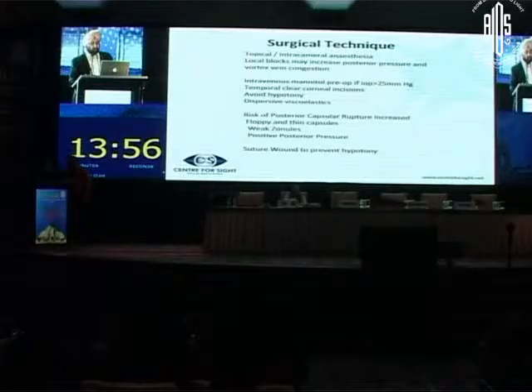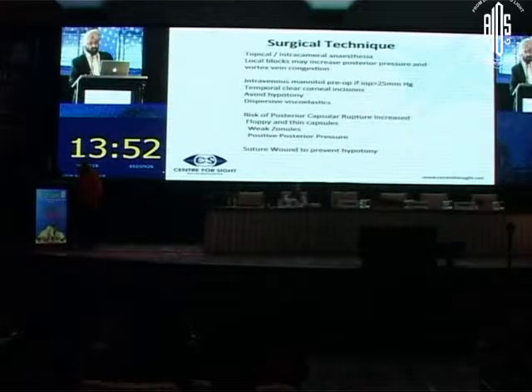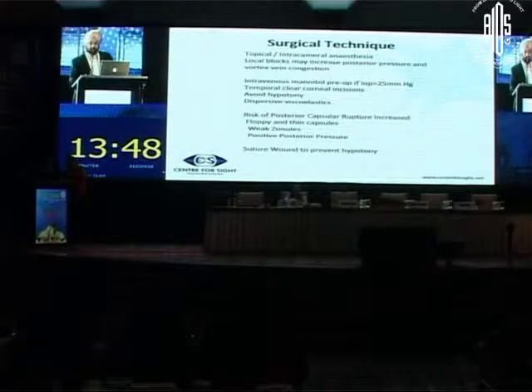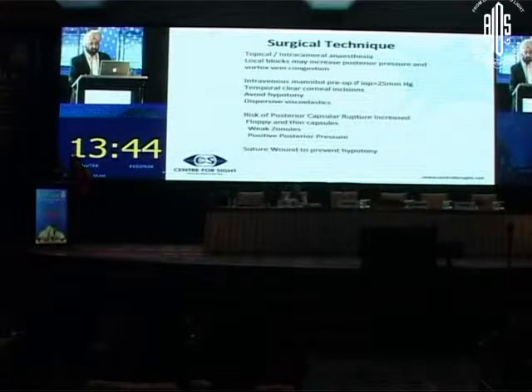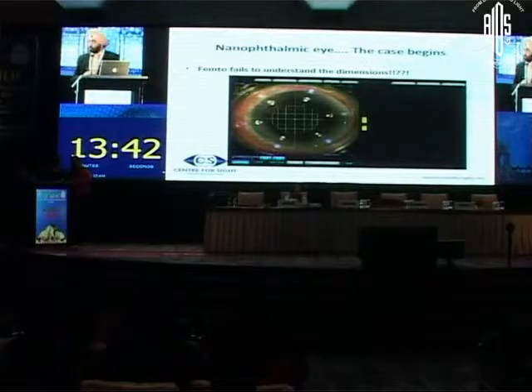Use good viscoelastic, and the risk of posterior capsular rupture is definitely increased because of the floppy and thin capsules, the weak zonules, and positive posterior pressure, and you might need to suture the wound because of hypotony. So let me show you a case of a nanophthalmos.